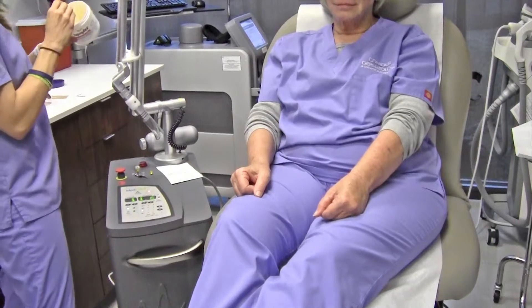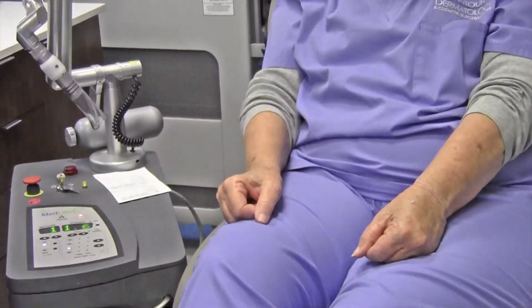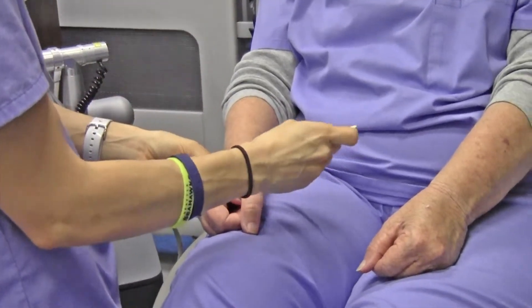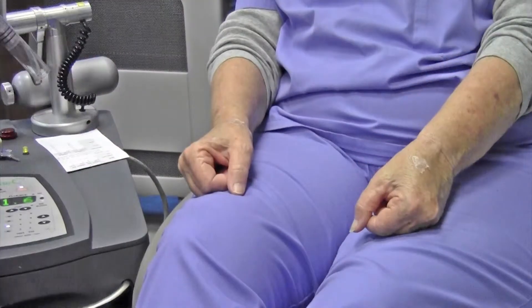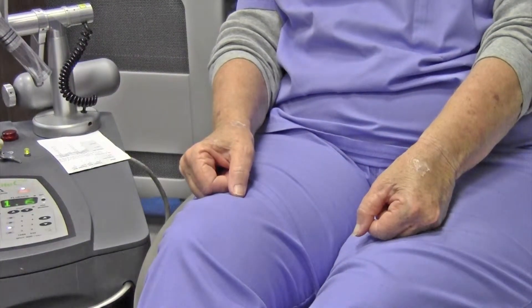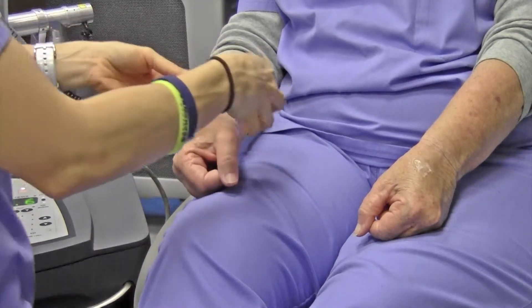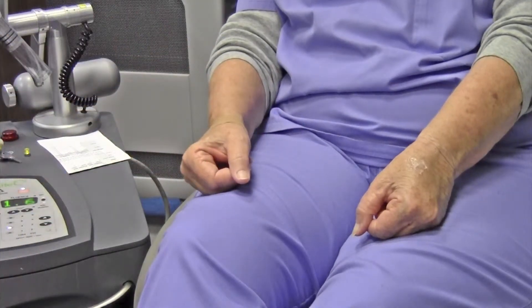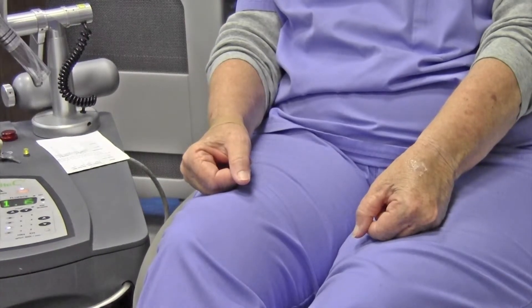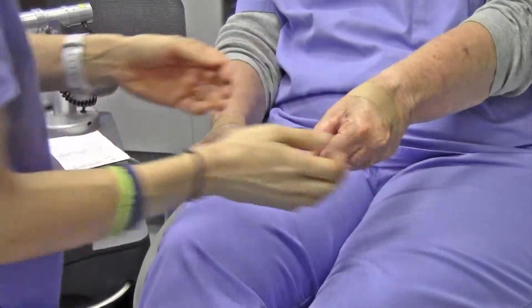Now the important thing that we do is we keep the area moist with ointment, such as Aquaphor or Vaseline. You also want to keep these little areas out of the sun — it's very important because they can actually turn darker in the sun. Just cover them, and she's all done.